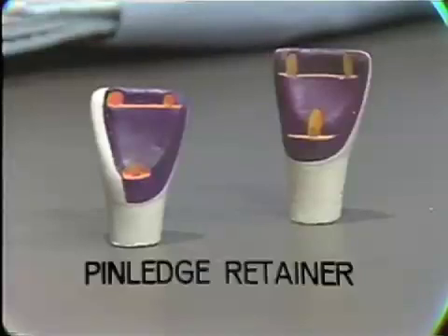Although the pin-ledge retainer is described in the dental literature back in the 1880s, it was not until the 1950s, with the advent of rubber-based impression materials, that it became extensively used. And since that time, it has been increasingly used, and as we have already said, tending to displace the use of the three-quarter crown on anterior teeth. Two typical pin-ledge retainers are shown on these models here.